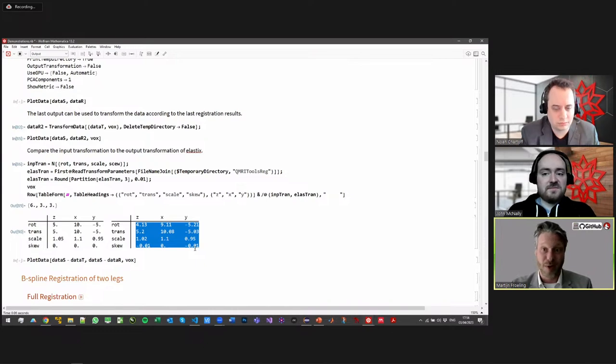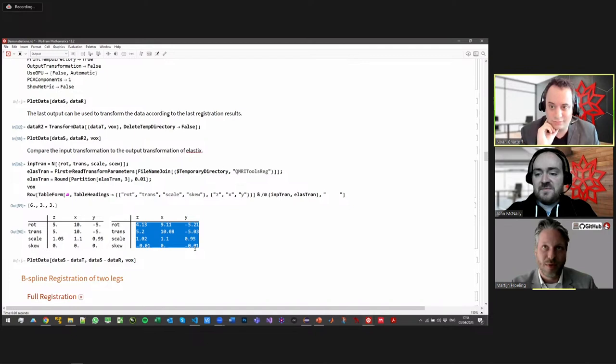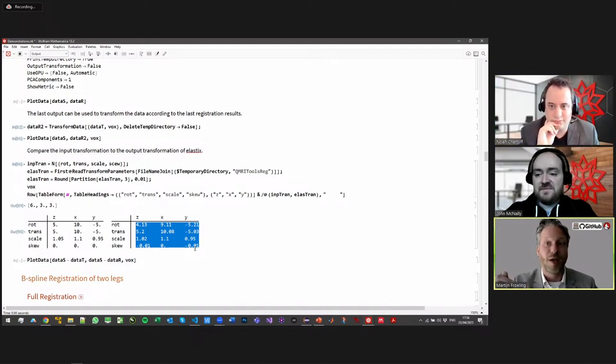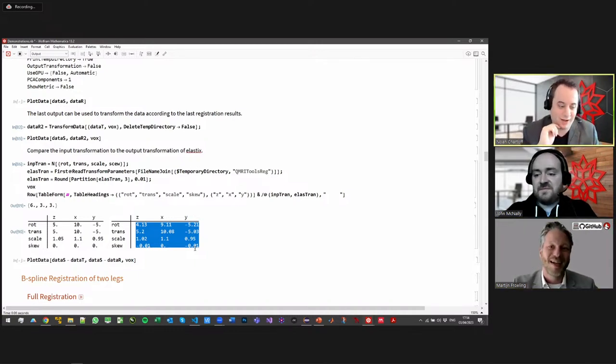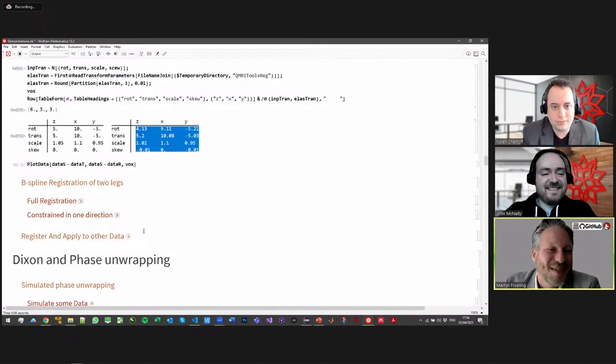And of course, then you still have to check everything, if everything went correctly, and those kinds of things. Because especially with fitting data to every image point, when I say we do forward modeling, I do this for each image point in the data set. So when you have 100 by 100 by 100 data points, that's sometimes a million evaluations for one data set. So it's not just fitting one function, it's running that same function 1 million times. There, the chance of you getting numerical errors or unexpected things happening is quite high. Especially when you run over hundreds of data sets, you will always get this one exception that will crash the entire system, and you have no clue why. Then you have to find the specific voxel where it happens. And then you have this rounding error that happens when you do optimization.